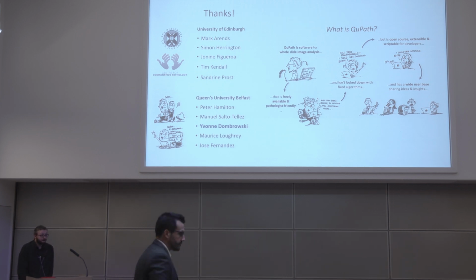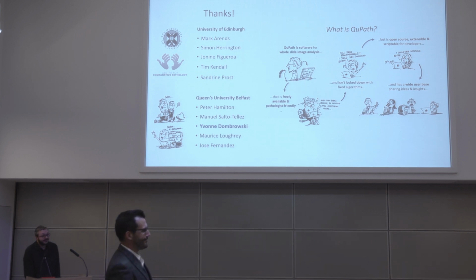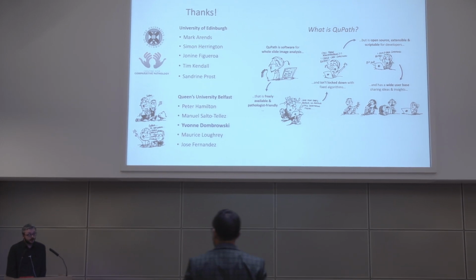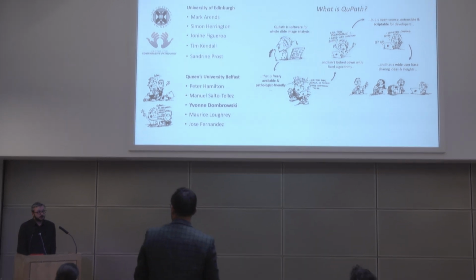I have a philosophical question. So I noticed you opened the JDK. How are we going to mitigate the harm that Oracle's very aggressive licensing of Java is going to cause to open source tools? So AdoptOpenJDK also has a Java 8 JDK.